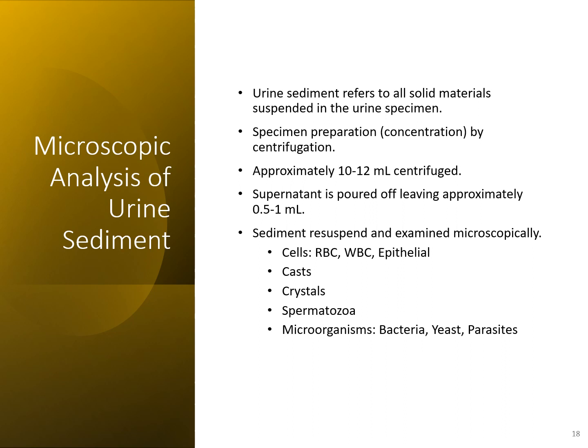What we look for is cells like red blood cells, white blood cells, and epithelials. We look for casts, crystals, sperm, and any sort of microorganism like bacteria, yeast, and parasites. And we also observe for any sort of artifacts that may be present as well.